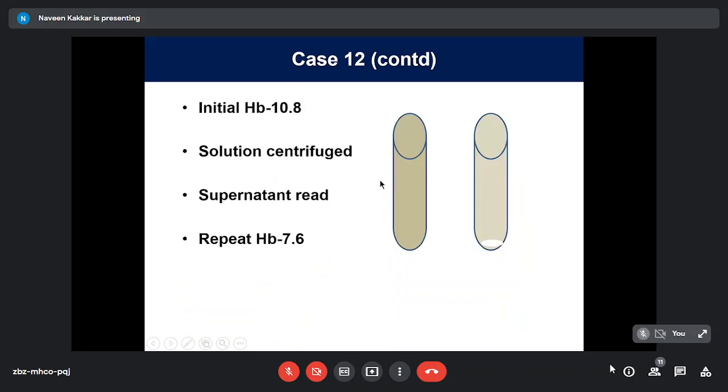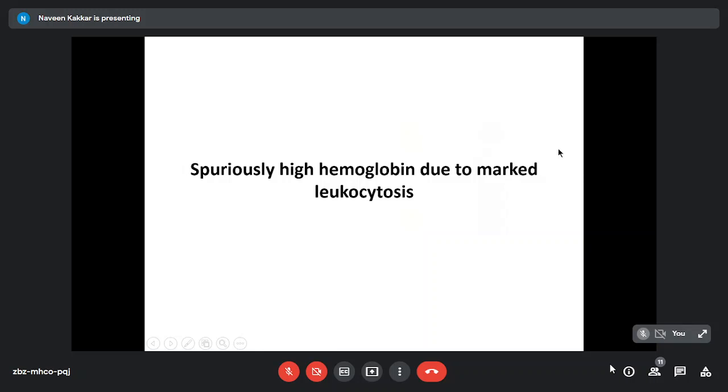Once the hemolysis is done, we centrifuge the tube and you might get a small, slightly whitish button at the end. This is all fragmented membranes of the white cells, the cells causing interference, now at the bottom after centrifugation. Now you can read the supernatant, and we got a repeat value of 7.6, 3.2 grams different than our initial value. So what are we dealing with? A spuriously high hemoglobin due to marked leukocytosis. It's a well-known artifact, but not very often worked up, because our prime worry in CML is more on the TLC, not the hemoglobin.